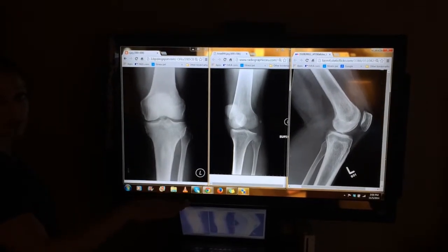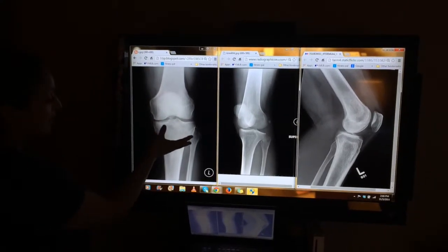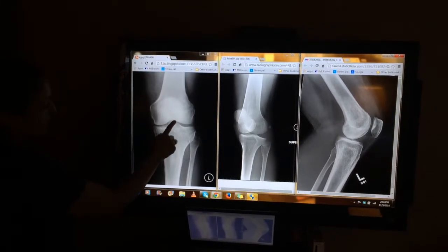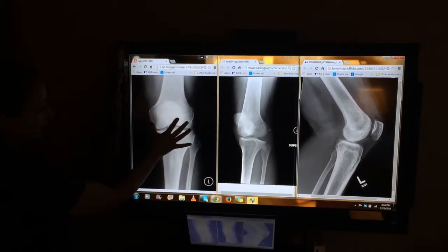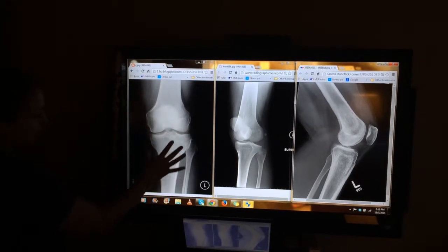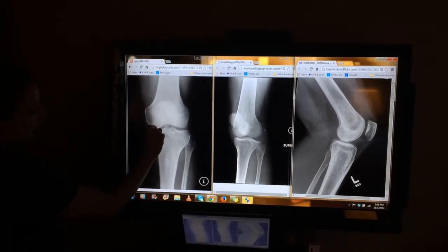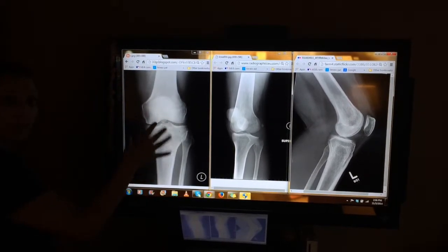These are our first three images of the knee. These were the images that were done in the Bucky. We have the AP knee, where the patella is superimposed on the femur. The epicondyles, or the condyles, are with no rotation. Neither is magnified. They're perfectly straight. There's a great joint space between the femur and the tibia. Each joint space is of about equal distance, which shows no rotation.